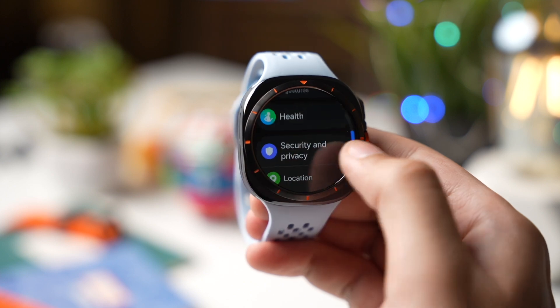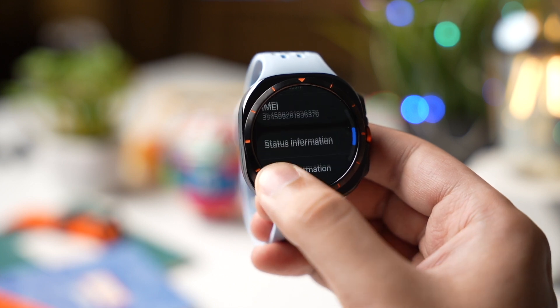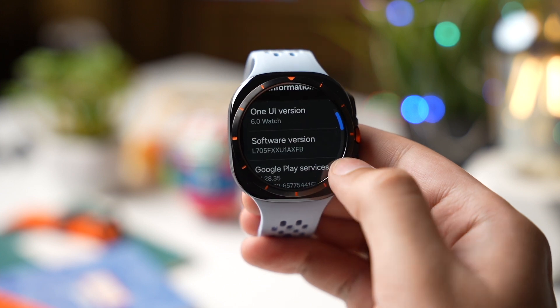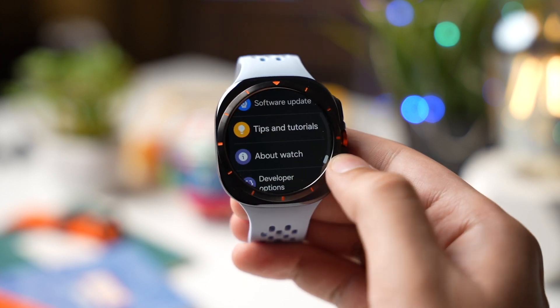After that go back and scroll down, then tap on About Watch. Choose Software Information and tap multiple times on Software Version. Developer mode will now be turned on on your Galaxy Watch.